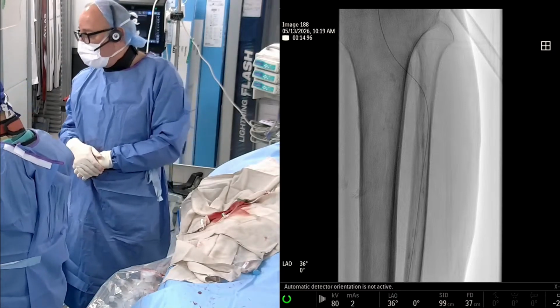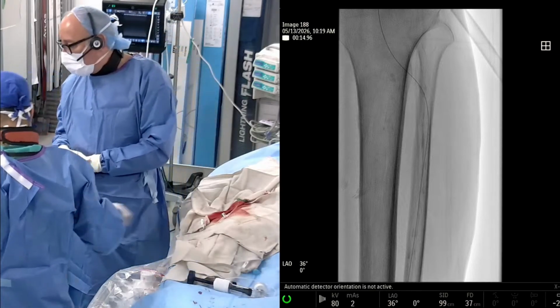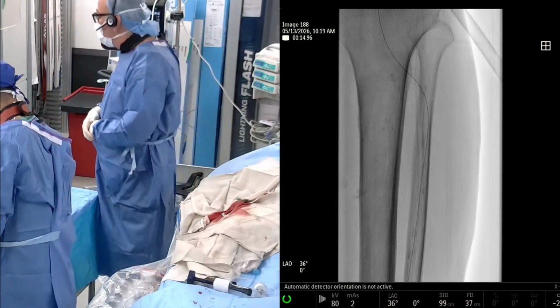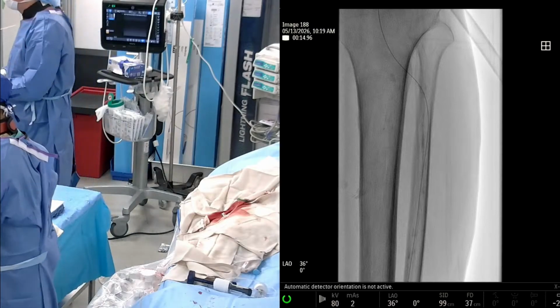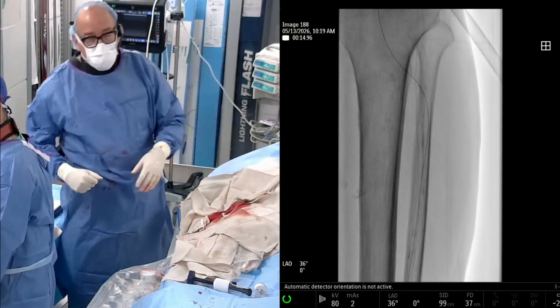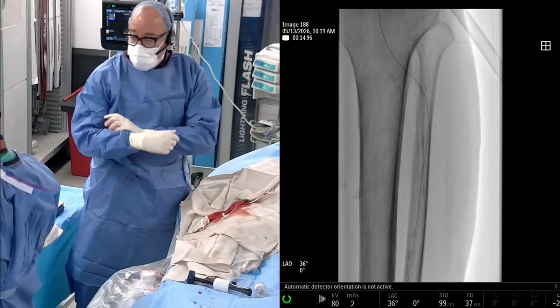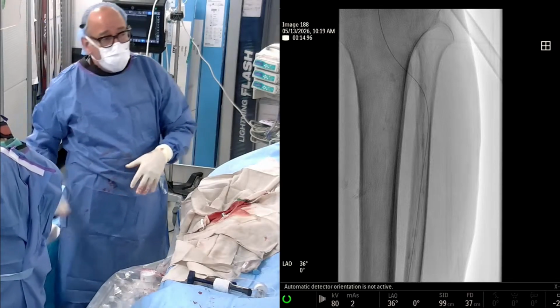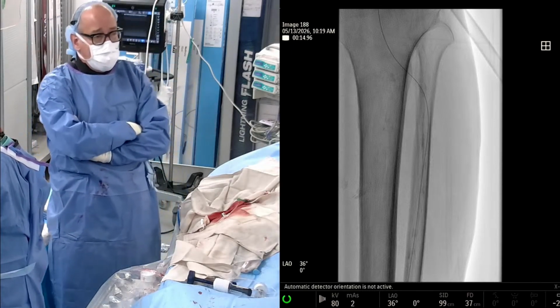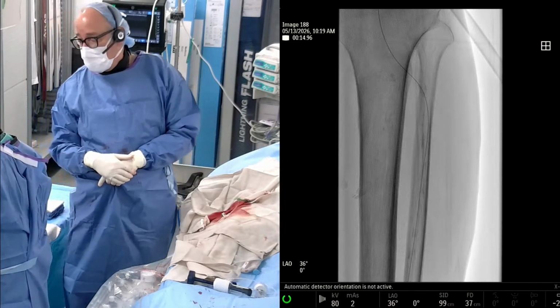Well, we have a new tech that we've been using in our lab that I'm looking forward to showing to you. So we're getting in a 3.0 150 balloon, and we're going to dilate the AT in 2 segments. In the meantime, can I have an ACT syringe, please?